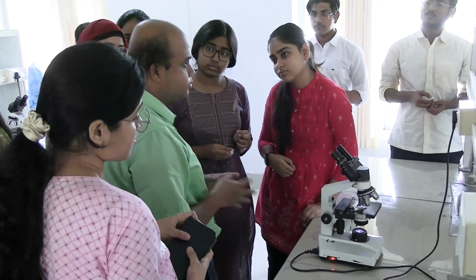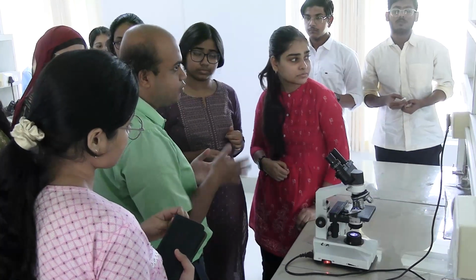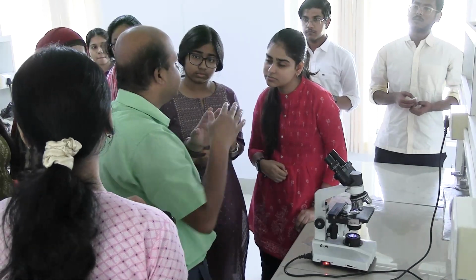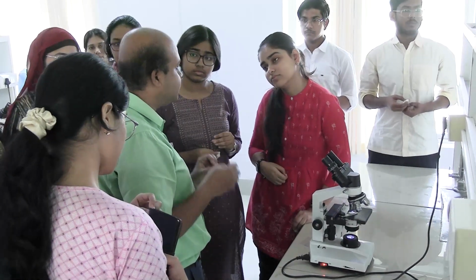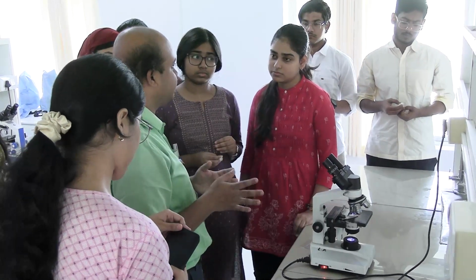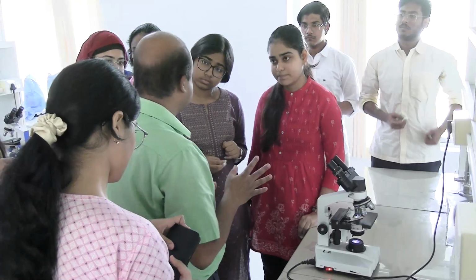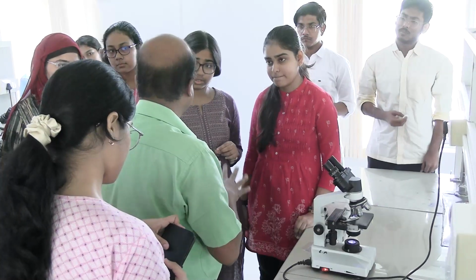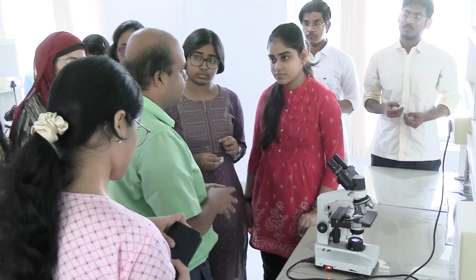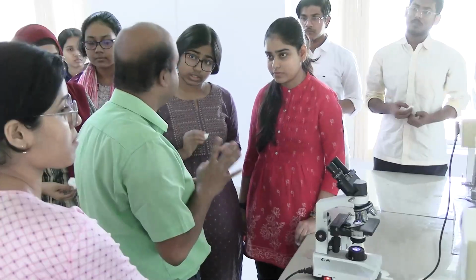So whenever you are asked why this drying is required, one purpose is that the disinfecting action of spirit takes some time, maybe 30 seconds to 1 minute, and by the time it dries up, the disinfecting action has come. The second reason is that blood should not get mixed with whatever disinfectant liquid we are using. So these are the reasons for drying it. After drying, you have to make a single deep prick.